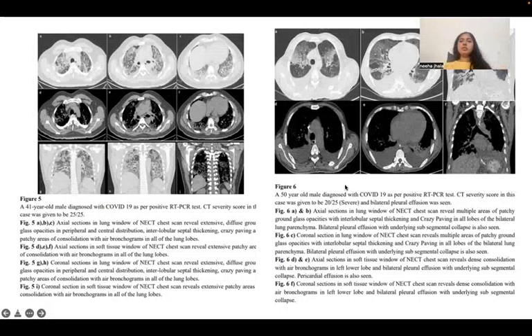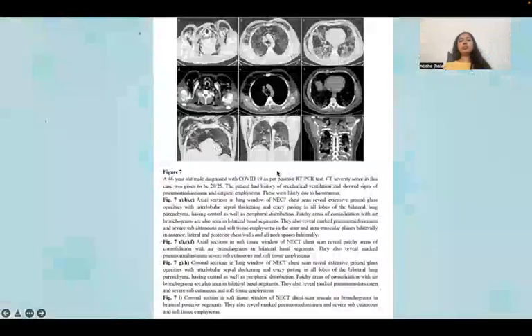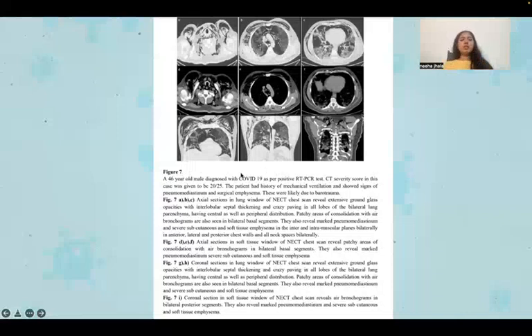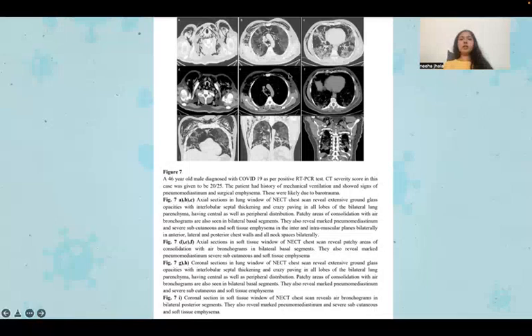In figure six, a 50-year-old COVID-positive patient with a CT severity score of 20/25 shows bilateral pleural effusion. Figure seven represents a 46-year-old male diagnosed COVID positive with a CT severity score of 20/25 who had a history of mechanical ventilation and showed signs of pneumomediastinum and subcutaneous emphysema due to barotrauma, visible on axial sections in both lung and soft tissue windows.